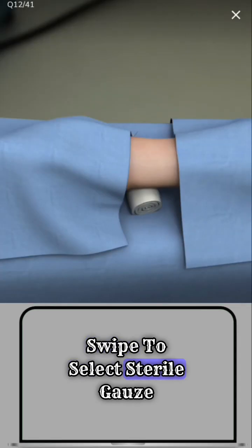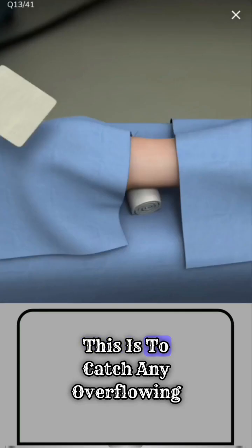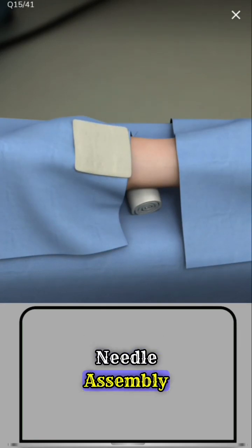Swipe to select sterile gauze. Place the gauze distal to the pulse. This is to catch any overflowing blood from the needle insertion. Swipe to select the catheter and needle assembly.